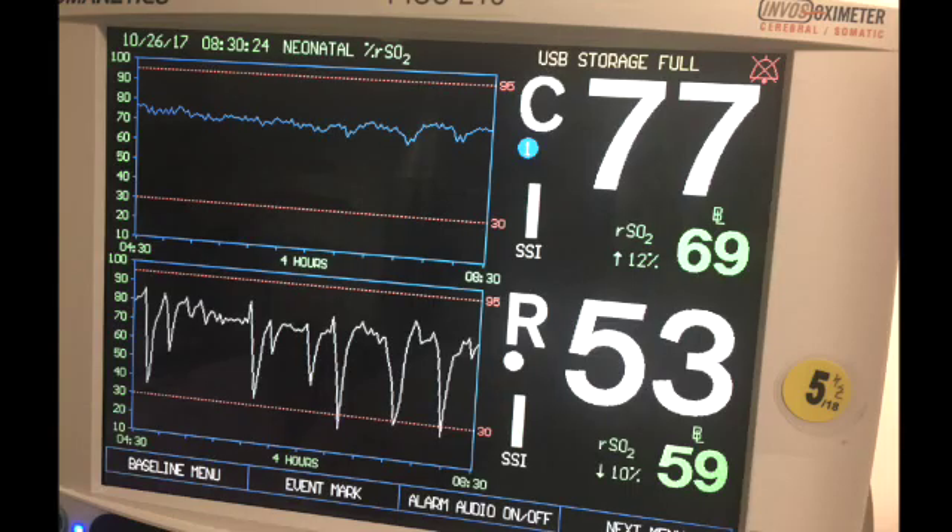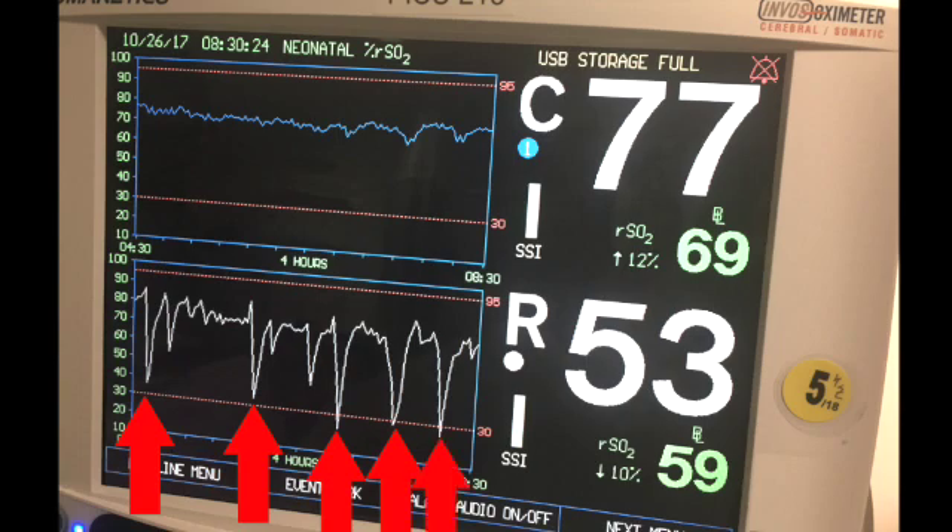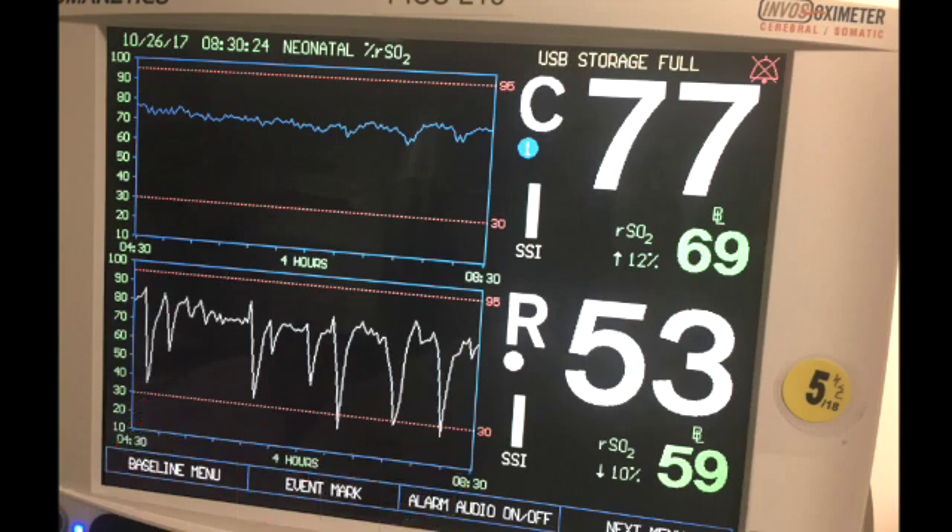And last example: this baby has acceptable NIRS a lot of the time, but what is going on here? Every time the baby gets mad and fusses, the renal NIRS plummet. This baby's heart is capable of delivering adequate oxygen to the body at rest, but can't increase cardiac output when the baby's needs increase. The baby may look fine and cute sleeping, but I would consider them high risk for the poop of death.